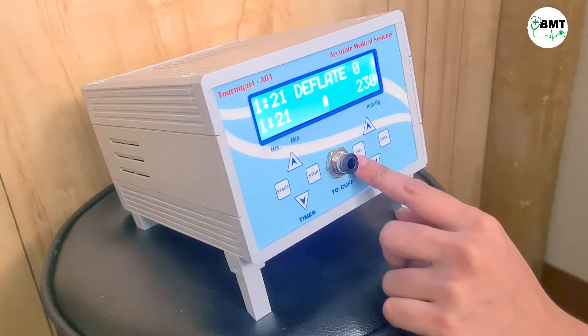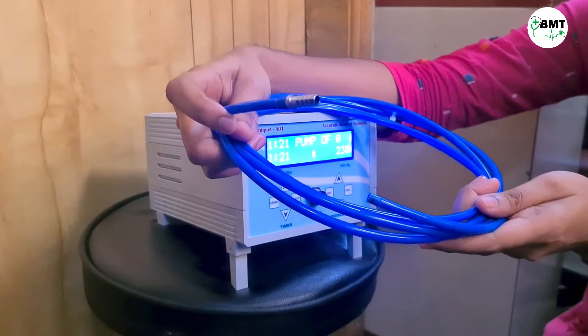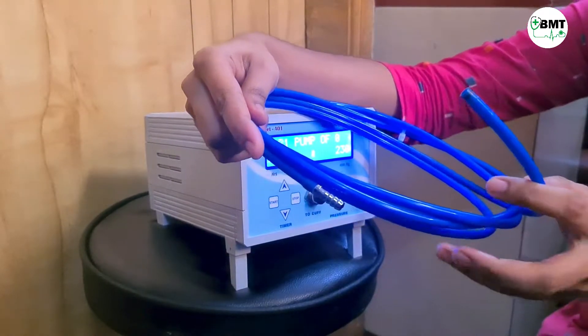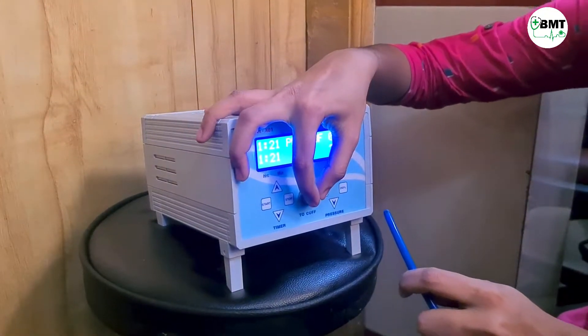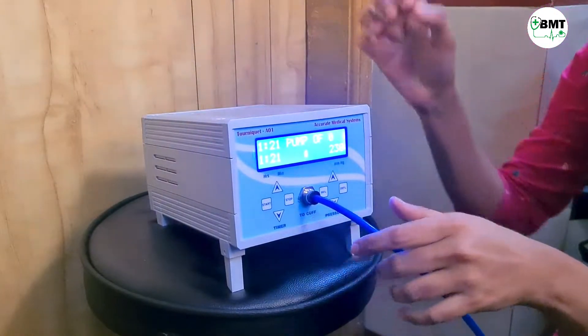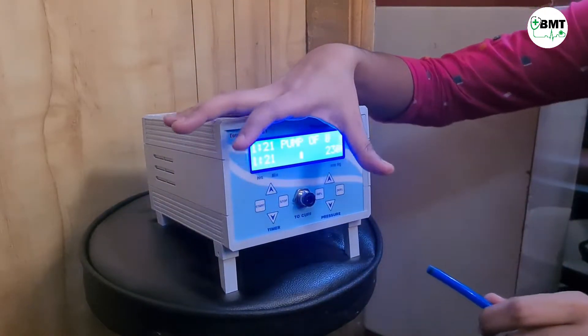Here you have to connect the cuff. This is the blue cable — this part connects towards the cuff side and this connects towards the machine side. To connect it to the machine, insert it in and press clear to fix it properly. While removing, press and pull.